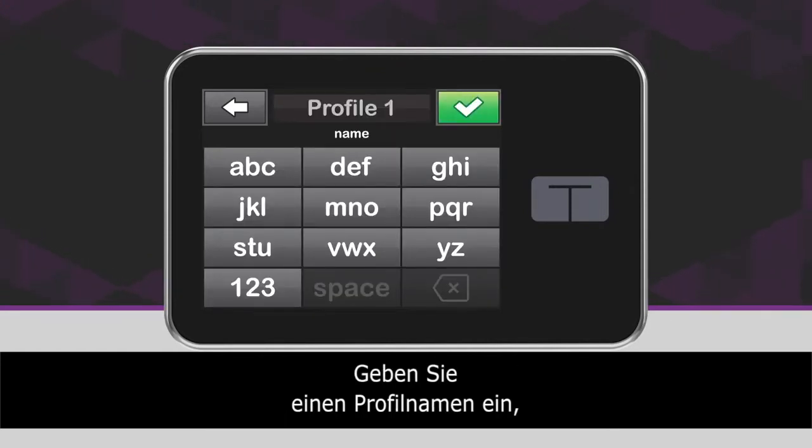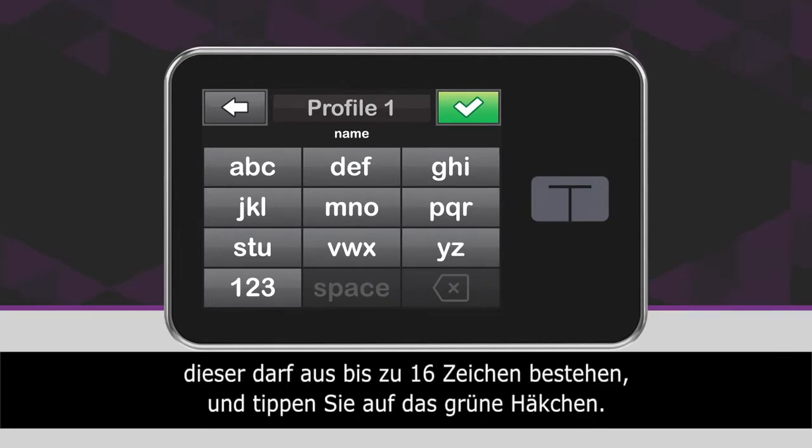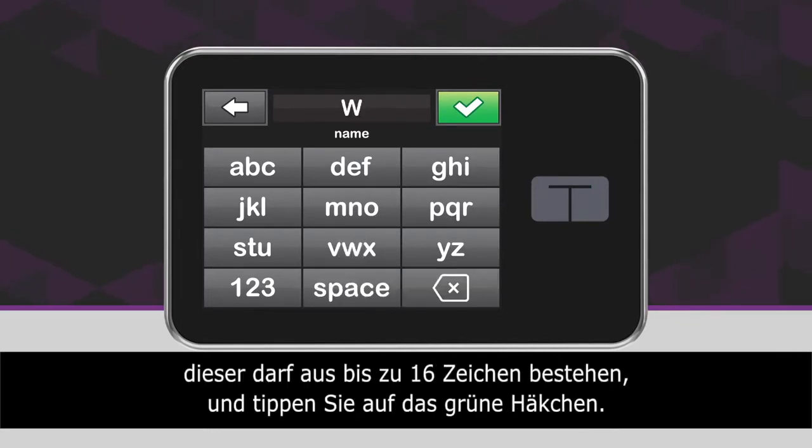Using the on-screen keypad, enter a profile name up to 16 characters, and tap the green checkmark icon.